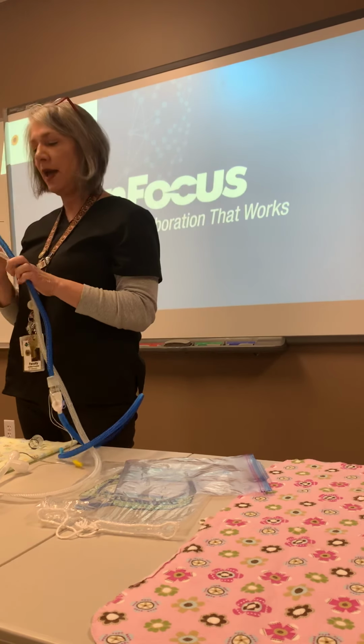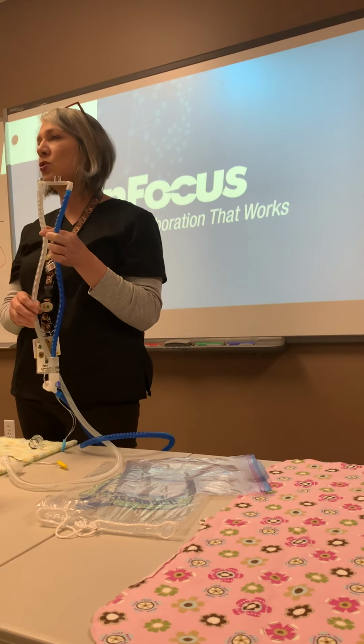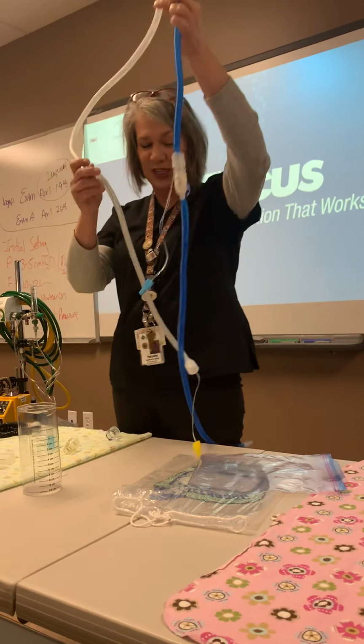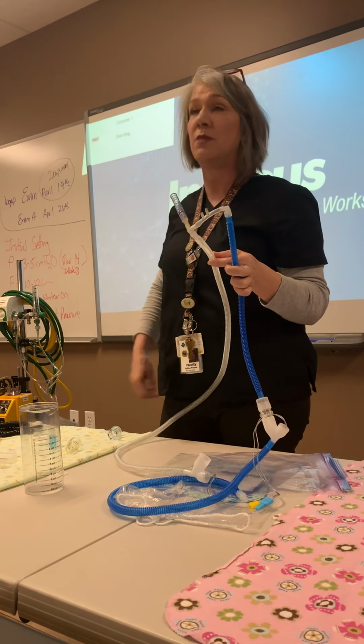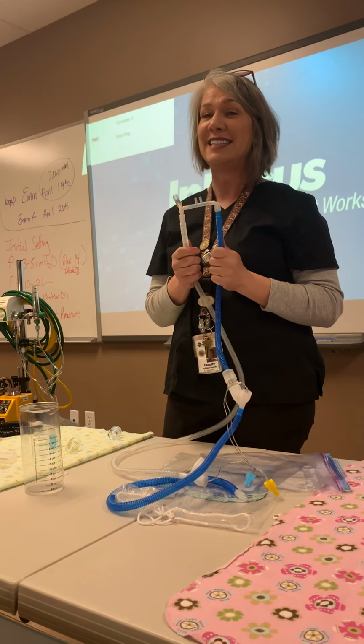Even with CPAP, some air still goes into the stomach, so I need a source to draw it off. Next, you need a baby. I need a distressed baby. Distressed is very key, because I'm not going to put just any old baby on CPAP. And last but not least, a physician order.